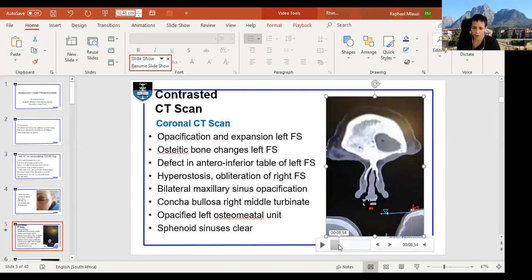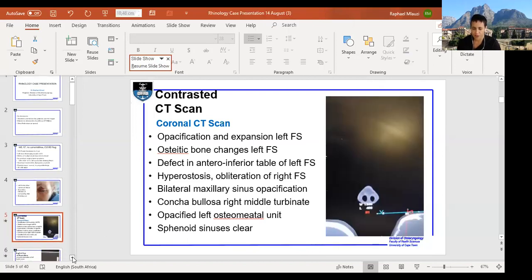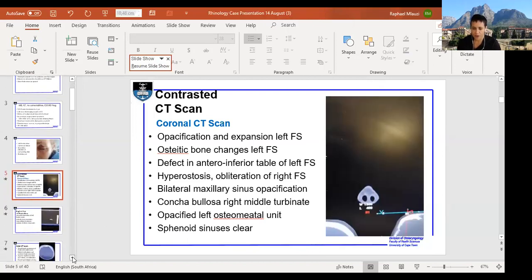So if you look at a patient, when are they candidates for endoscopic Lothrop? You want to look at whether there is one frontal sinus or both frontal sinuses, because by definition with the Lothrop, you communicate your left and your right side. In this case, the patient only really has a left-sided frontal sinus, so you can't really do a Lothrop. Then you look at the sagittal and you really want about 1.5 centimeter anterior posterior diameter to be able to do a drill out. So in this case, I felt that that was not going to be possible.